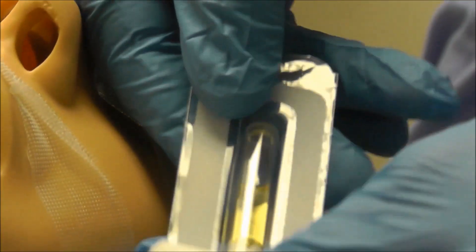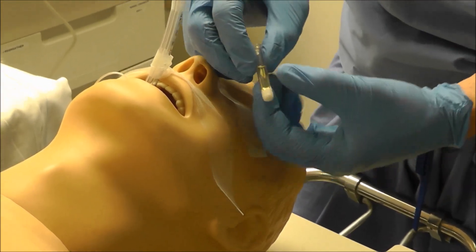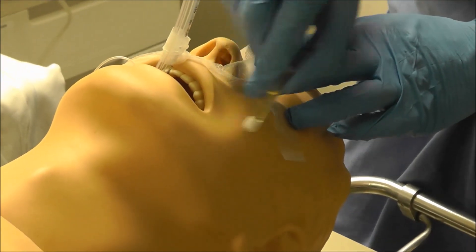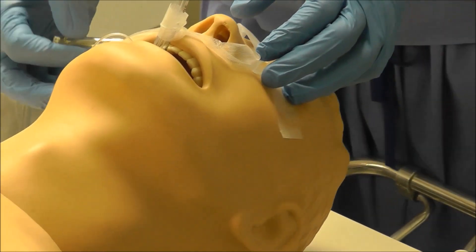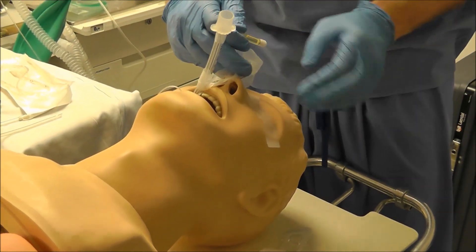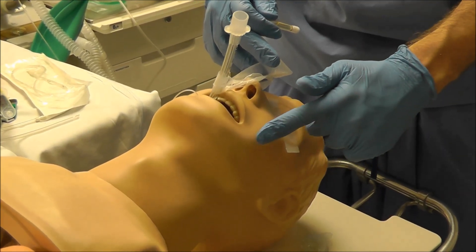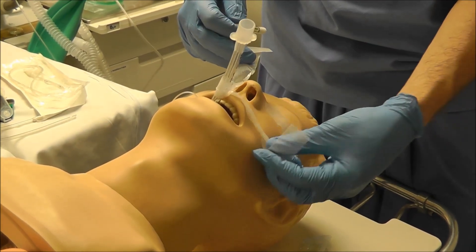I'm going to open this up. I'm not going to actually put Mastisol on this simulator because I don't want to clean it off. But really what you do is you just break this seal, squeeze and break it, and then you would apply it to where the tape is going to go. It's going to be wet, and then you apply it on this other side. You just have to fan it dry because it has to dry before it works. But once it's dry, it will be incredibly sticky on the patient's face, so your tape would now stick.